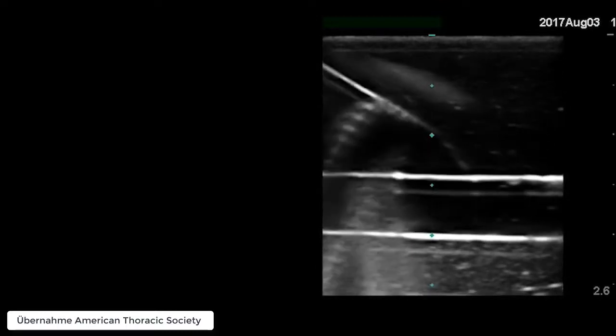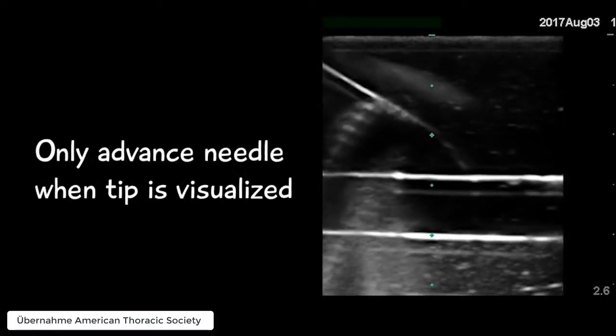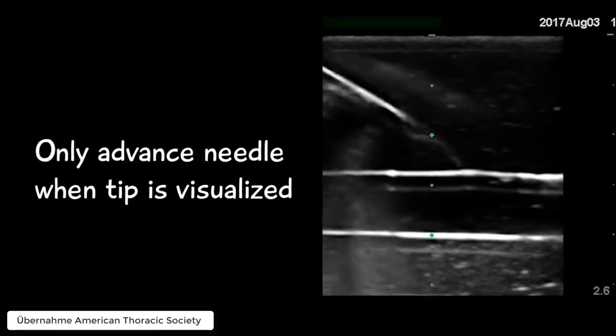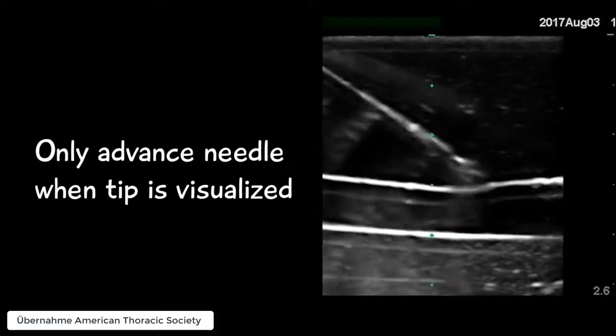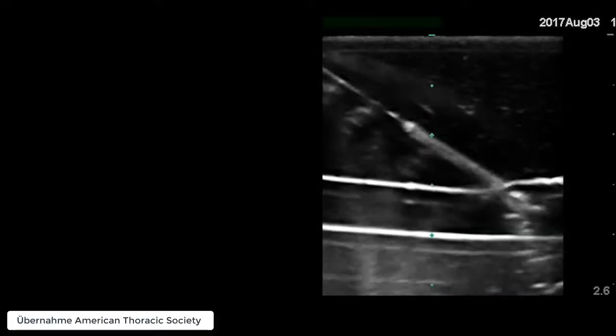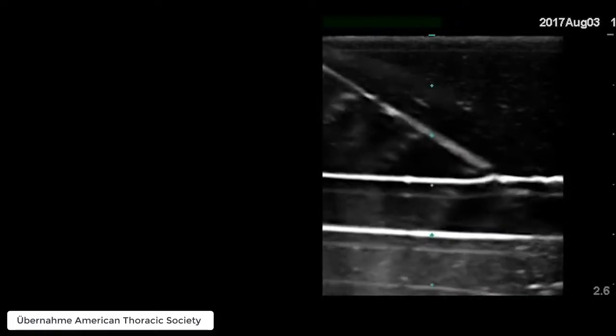This is dangerous as the needle tip advanced without visualization is at increased risk of injuring the lungs and subclavian artery. If this occurs, the needle should be retracted. It should only be advanced if the needle tip can be visualized to avoid complications.